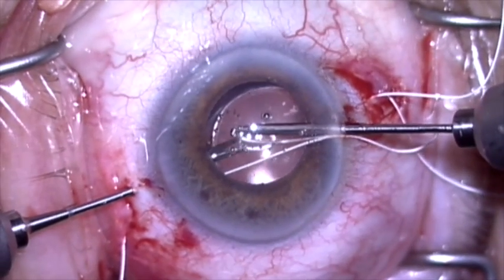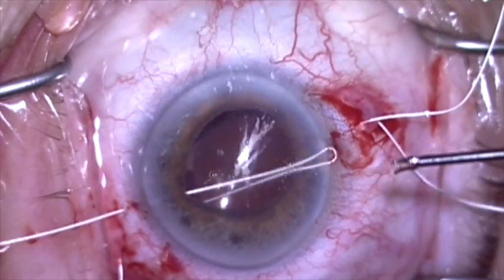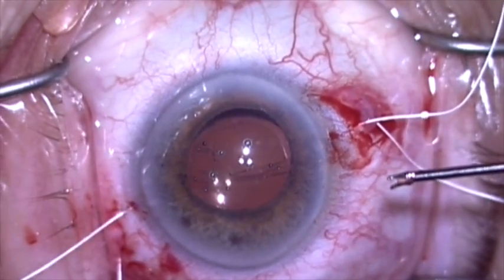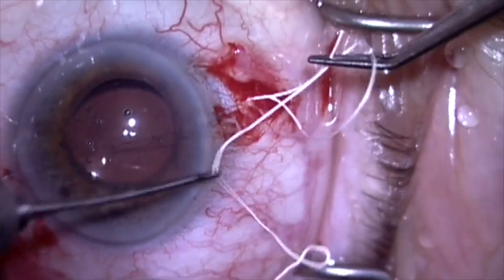I'm going to grasp the suture, pull it out through the superior sclerotomy, and now when I tie this it'll secure the lens on each side.